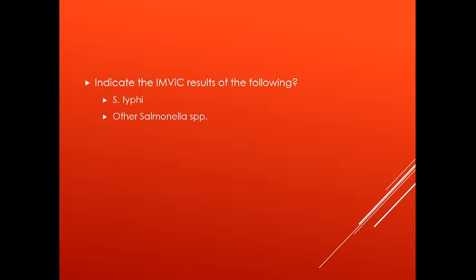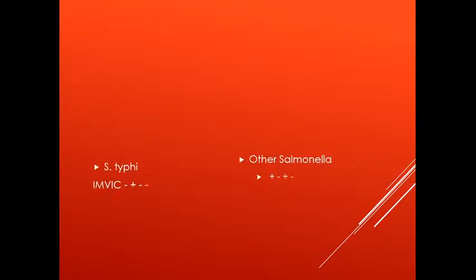Okay, so Salmonella typhi is different from the other members of its genus, because Salmonella typhi will test negative, positive, negative, negative for IMViC. And other Salmonella species would test positive, negative, positive, negative. Okay? So see why we want to discuss the IMViC results? Because it's important for you guys.